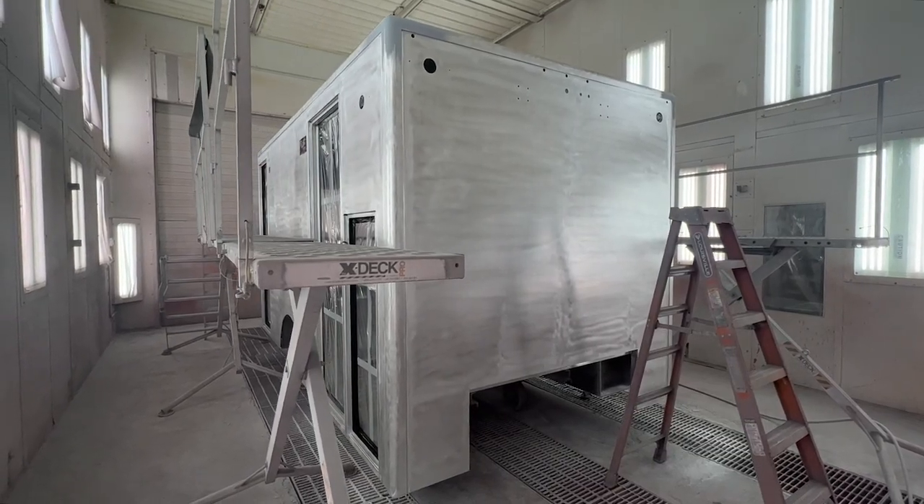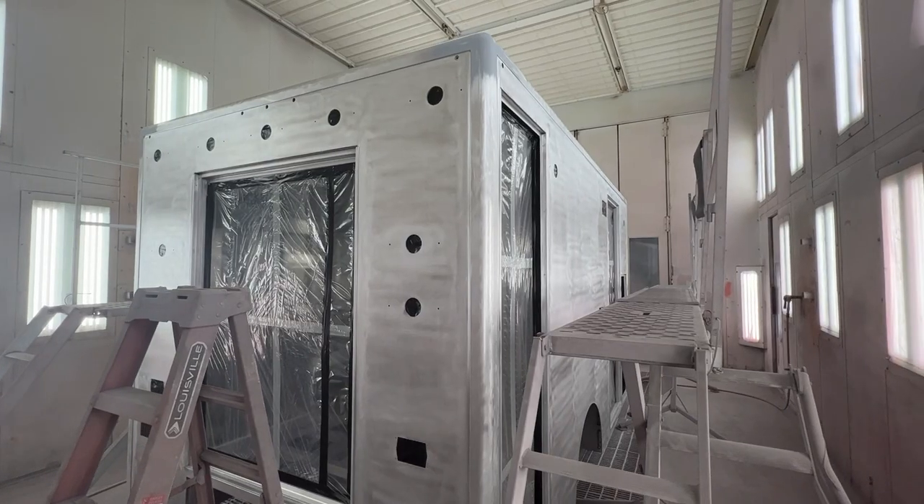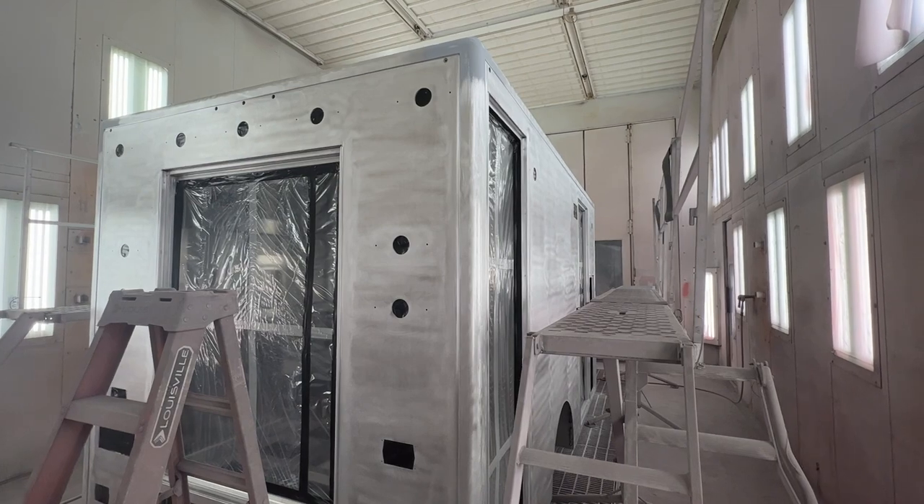Hi, this is Chad Dennison with PL Custom Emergency Vehicles. As a follow-up to our paint prep video, this video will focus on the painting process of the ambulance body.